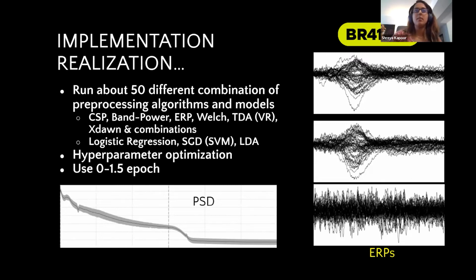And when we were not filtering the data properly using a notch filter or a high pass filter, there was a bump at around 50 hertz. And this parameter was also mentioned in the paper. So we got an idea that we really need to apply a notch filter around 50 hertz. So it was a lot of trial and error and sharing each other's code on GitHub, seeing whose parameters are working and which type of combinations really work for the best classification accuracy.